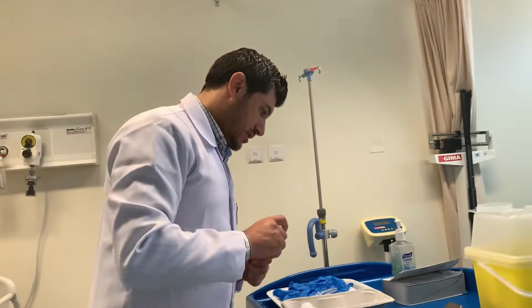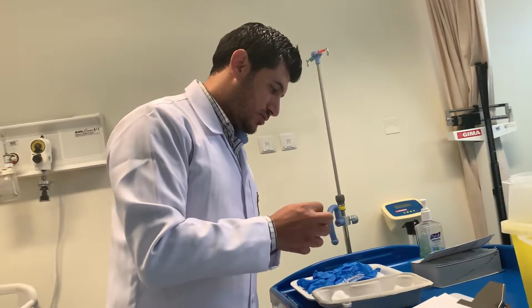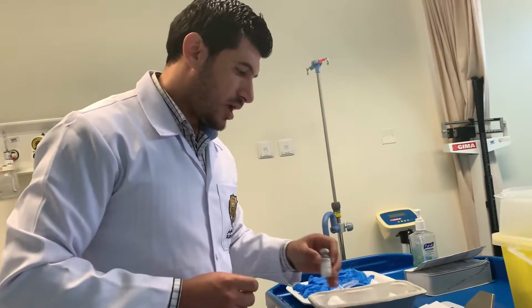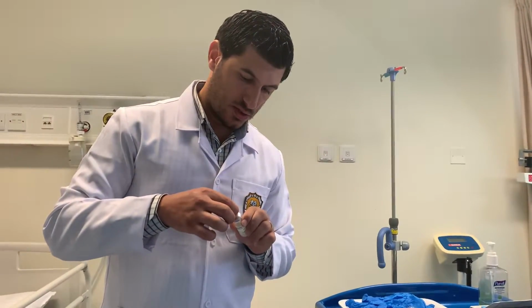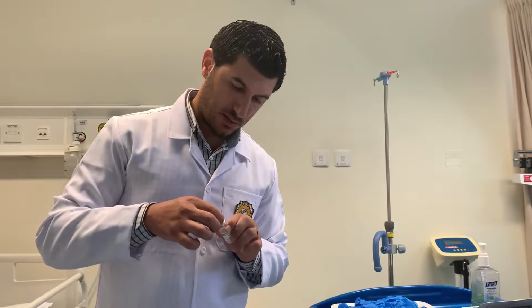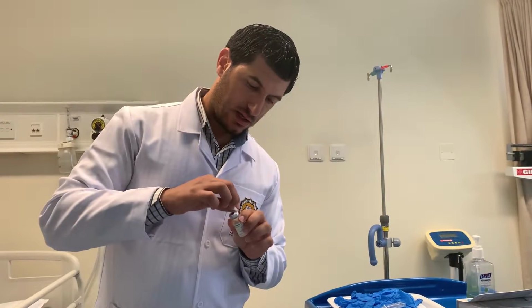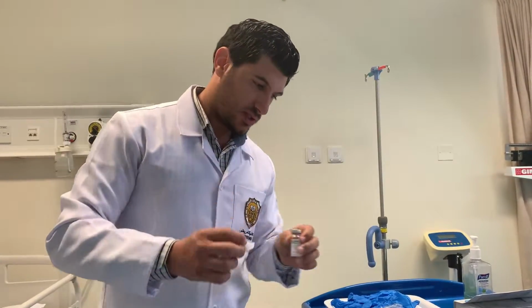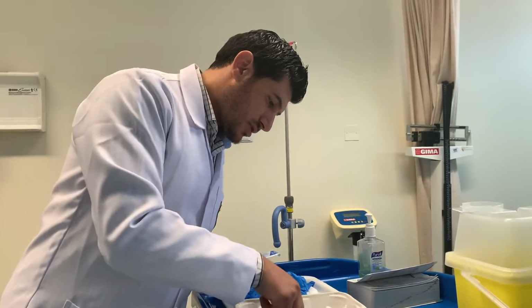We need first to clean this ampule because it is multi-use, and we need to make sure that there are no germs. I will clean from the inside to the outer side, so I will take the germs from inside and keep them out. In case there is any infection, I will just take it out. Then we need to aspirate.